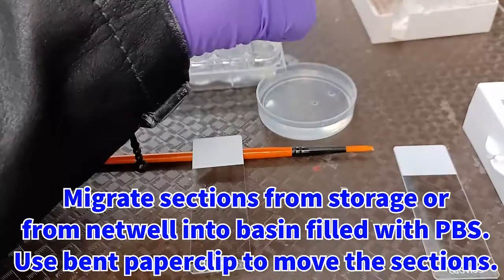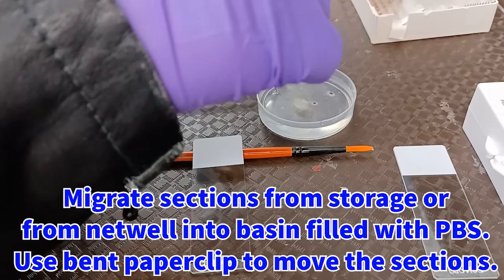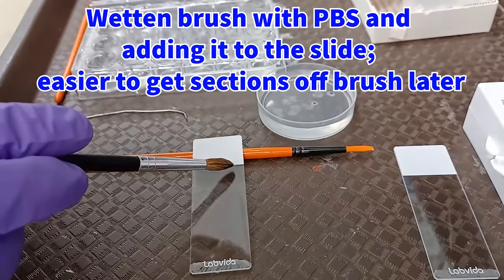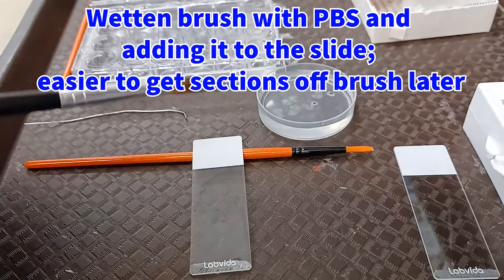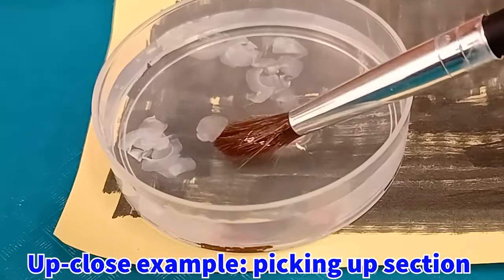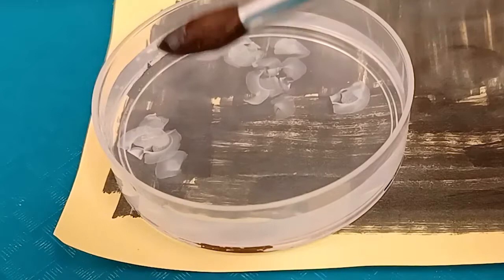Begin by migrating the sections from storage, or from their netwell, into a basin filled with PBS. Use a bent paperclip in order to move the sections. Wet a paintbrush with PBS solution and add that solution to the slide — it makes it easier for the sections to come off the brush when you mount them. Pick up sections from the dish with the brush by gently swooping the brush underneath the section and lifting it out of the solution. Here is an example of mounting a section steam-roller style by positioning the section between the brush and the slide and rolling the brush over the top of it.